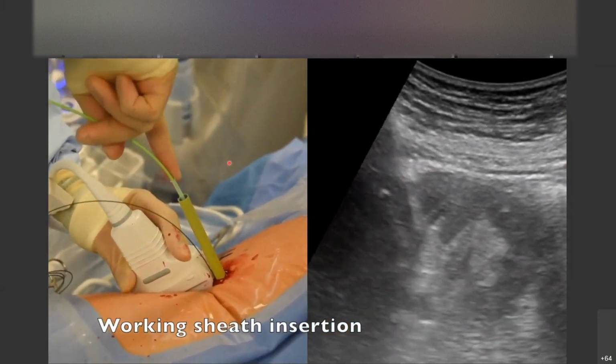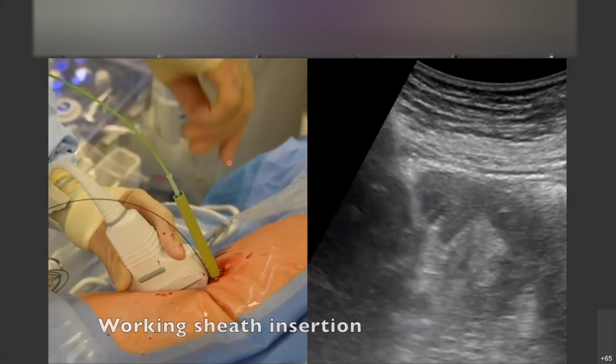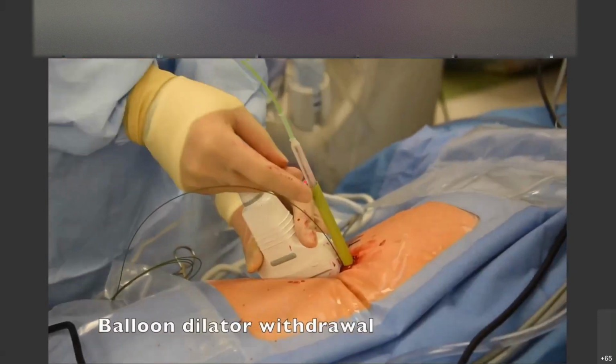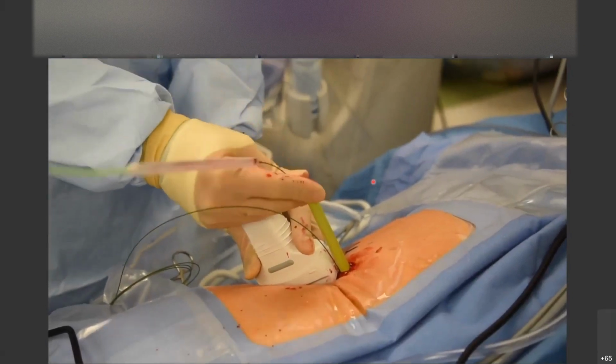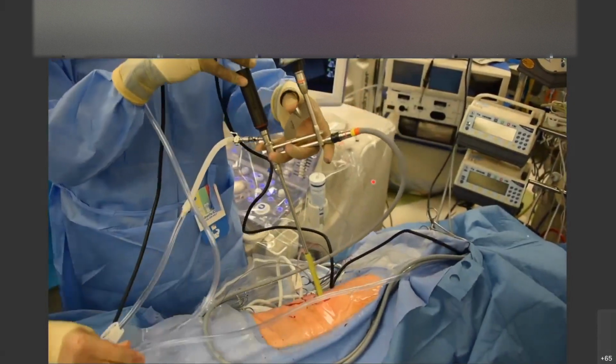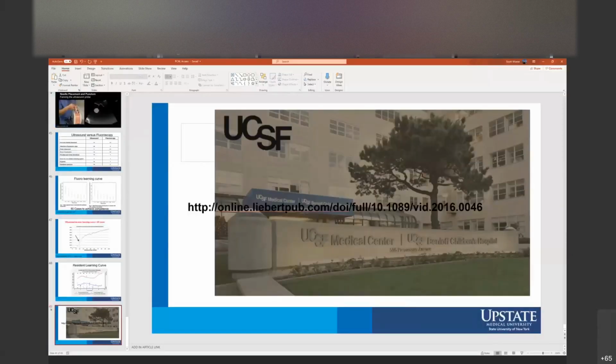So under ultrasound, it's really important to look at your sheath as you advance because you can't always see it on the ultrasound, but when you can see the back of the balloon, you know you're in a good position. And we're in. I often will place nephrostomy tubes as well in these situations, so you can use ultrasound to do that too. So that's all I have right now. Are there any questions?